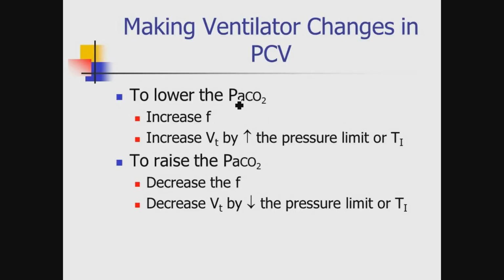So again, PCO2, if my PCO2 is too high, I can check the rate, adjust that, go up on the rate, raise the minute volume. Same would be true by getting a bigger tidal volume by pushing the pressure up.